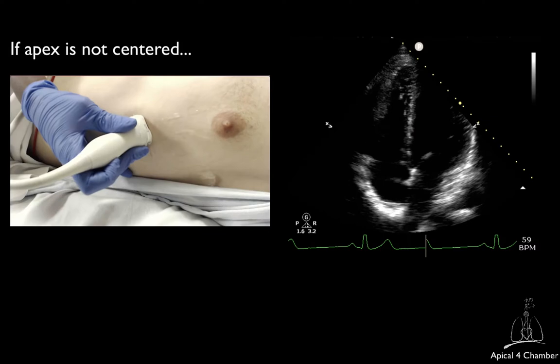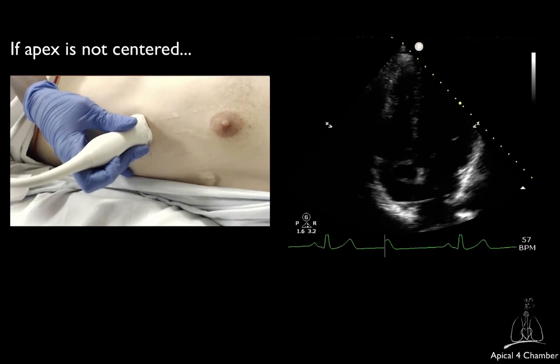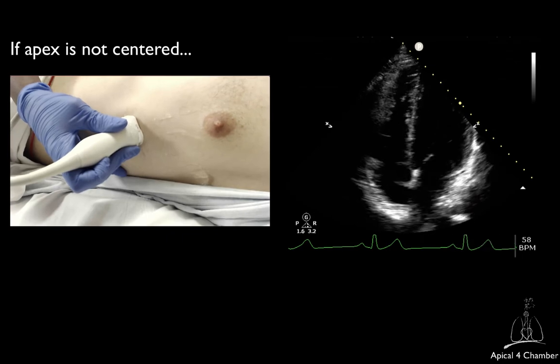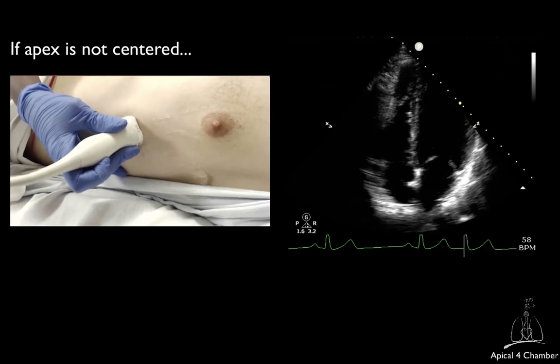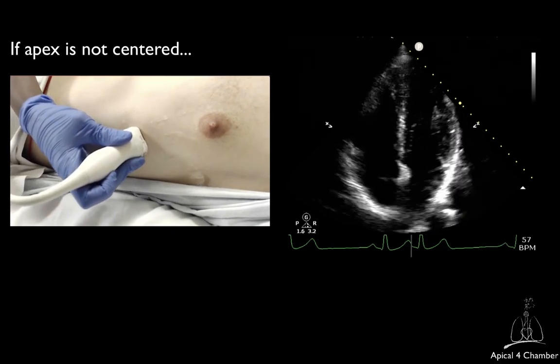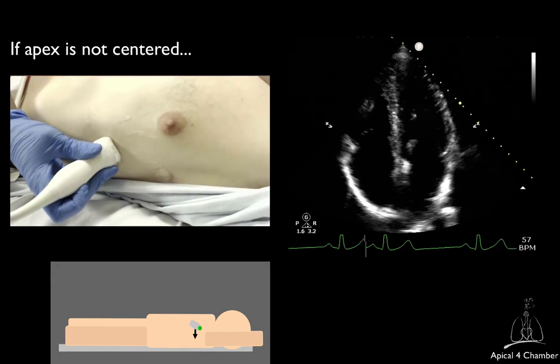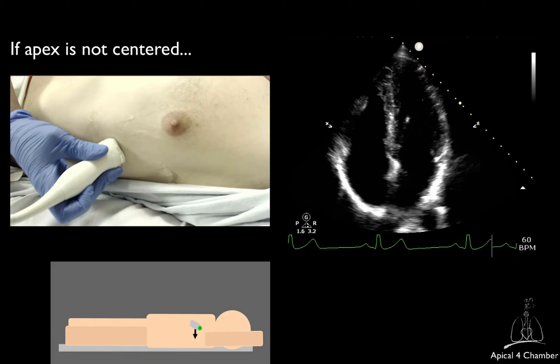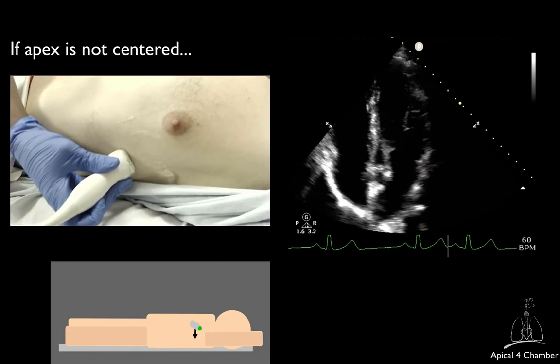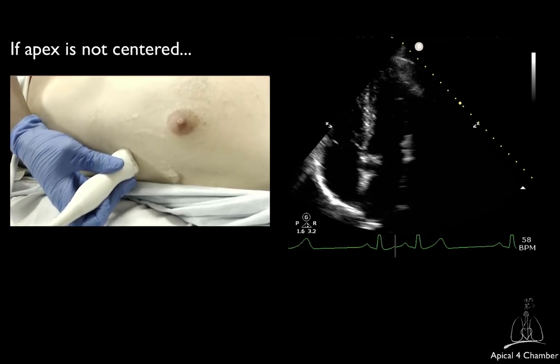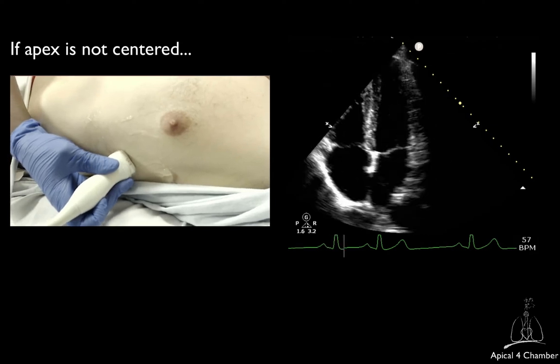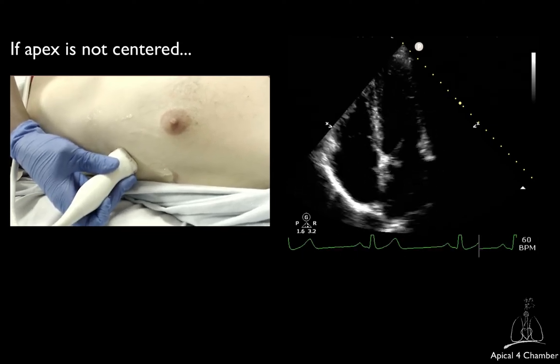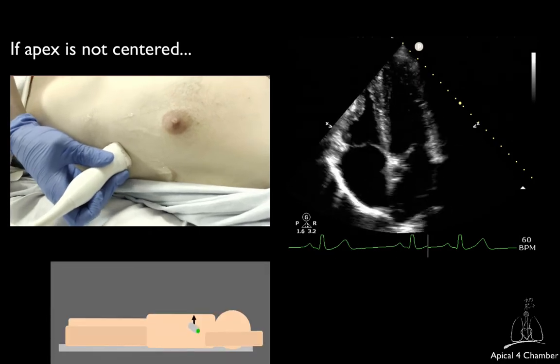The apex not being centered is one of the most common problems. If the left ventricular apex is positioned towards the right side of the screen and you see mostly the right ventricle, you will have to slide the transducer more laterally. Conversely, if the left ventricular apex is positioned towards the left side of the screen, you will have to slide the transducer more medially.